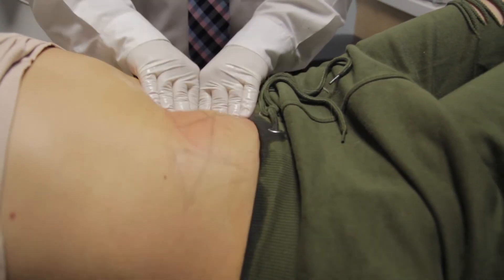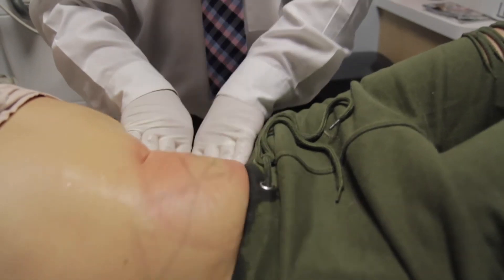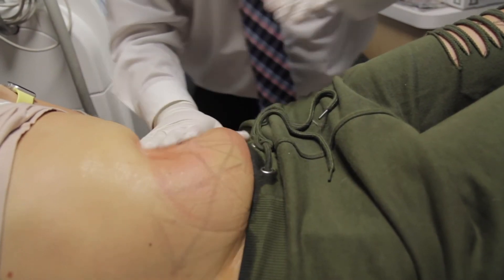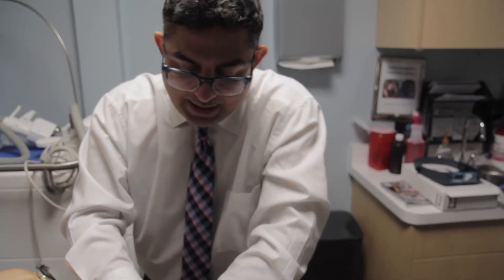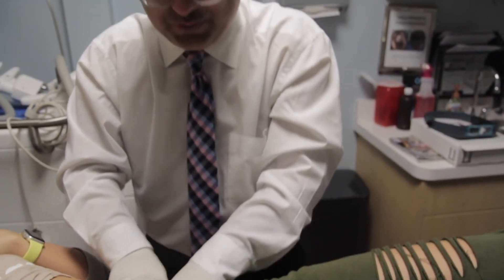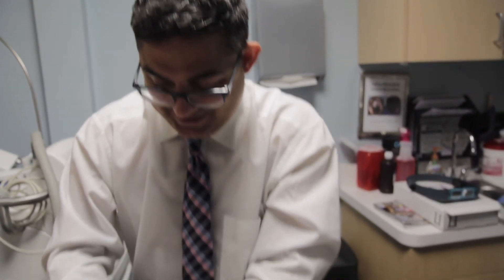After we're done, patients can really do anything they want. Probably take today off and take it easy, but you can go back to exercising starting tomorrow. A lot of patients ask when they can repeat the procedure — it's about two to three months. Optimal results are seen by the third month. Typically patients need anywhere between one to three sessions, three months apart if needed. Some people may bruise and the bruise may last about a week. Some may have tingling or numbness in the area lasting a few weeks, but that's also unusual. For the most part, it's a pretty safe procedure with a great response rate. My patients tell me that relaxing here for those two hours is one of the most relaxing times they've had in a long time.